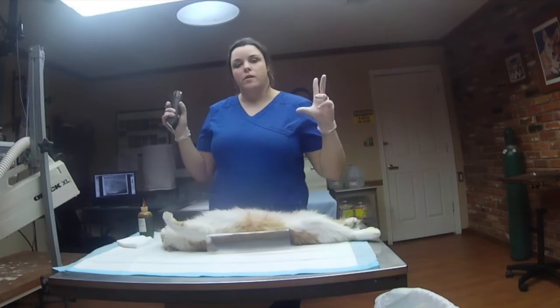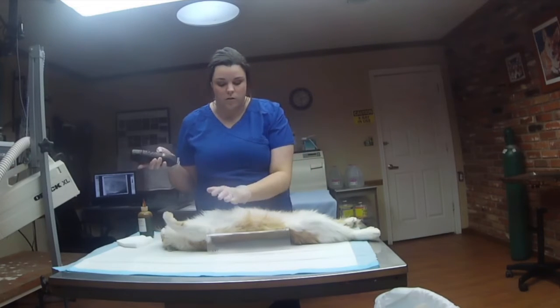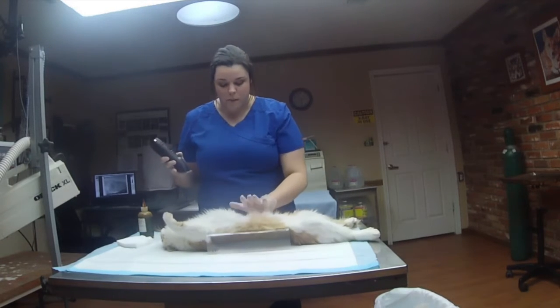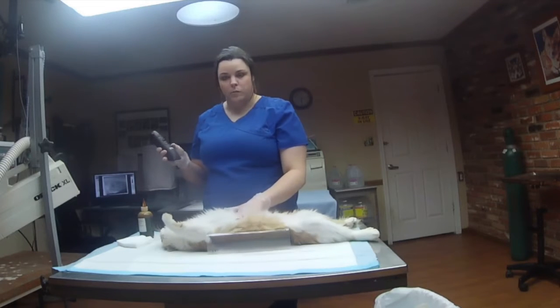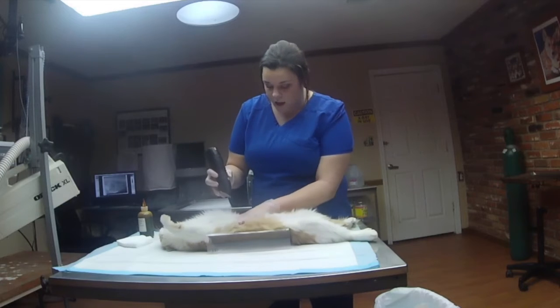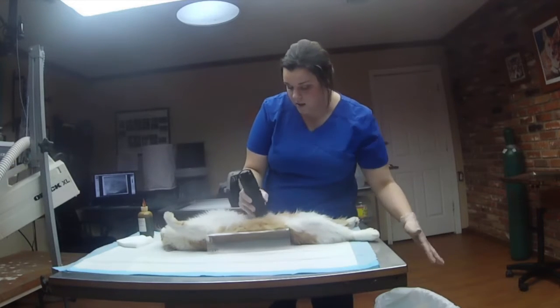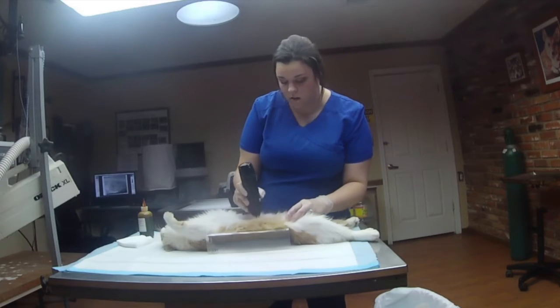To properly clip and prep for surgery, you're going to want to make sure that you shave for a spay all the way up to their xiphoid process, which is the bottom of their rib cage here. And you'll want to get all the hair away so that the surgical site will be sterile.